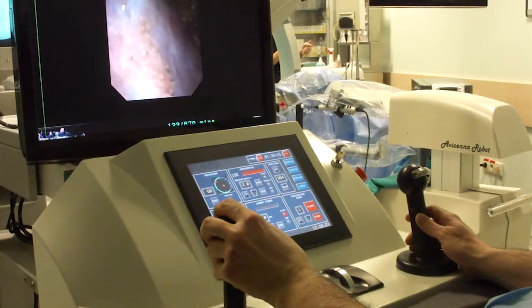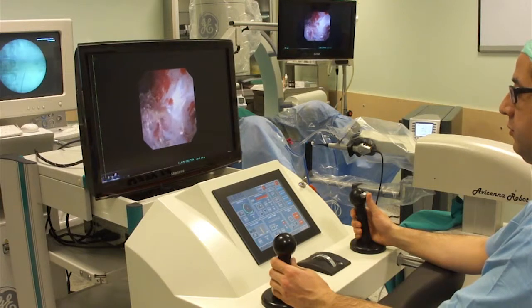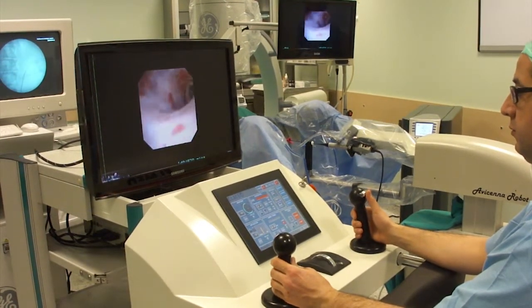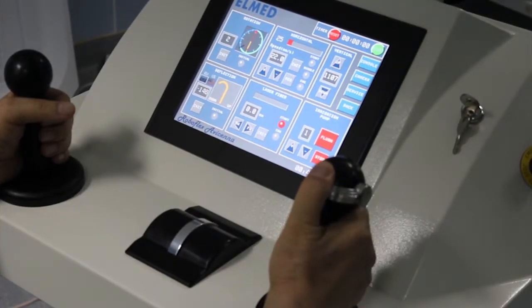To manipulate the endoscope, the surgeon controls two joysticks. The right one enables deflection, and is designed similar to the handpiece of any standard flexible ureteroscope.